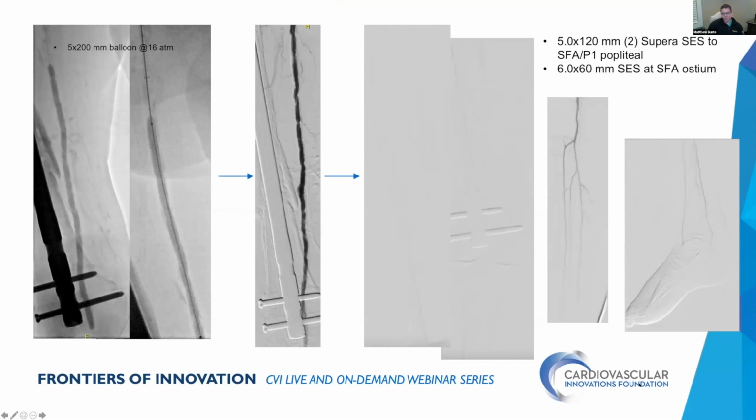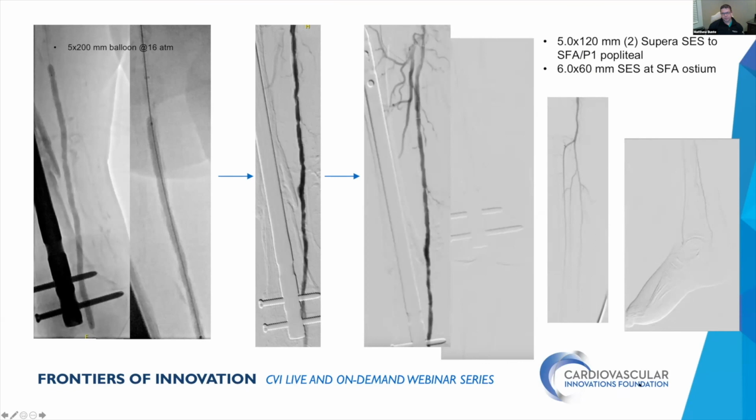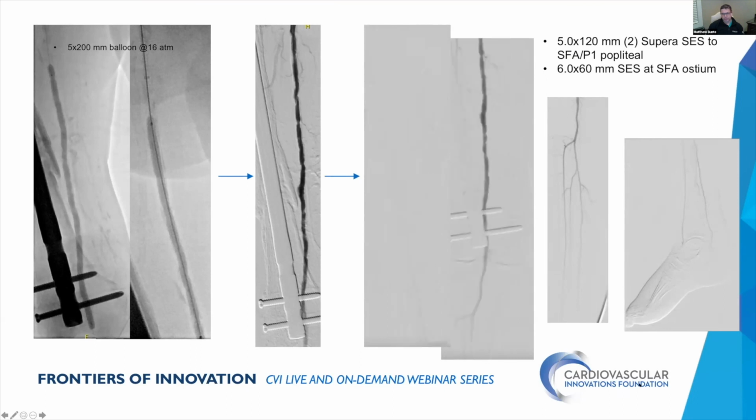But after lithoplasty, the balloon actually expanded quite nicely, and we were left with the result in the middle panel there after angioplasty. Then we placed Supera stents throughout the femoropopliteal segment and had a pretty decent result. We were pretty happy with that.